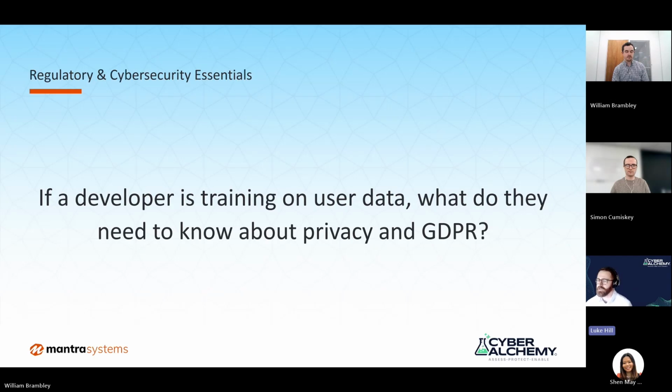It's really, really important as well that you're upfront with your users as to what's happening. They need to understand that their data may be used for training. It's really just a case of trying to reduce that risk wherever possible, because it can be a bit of a minefield if you don't fully consider all of the different aspects. So good controls would be around minimizing what data you're collecting, anonymizing it wherever possible, and keeping a good auditable trail of everything that you've got there as well.